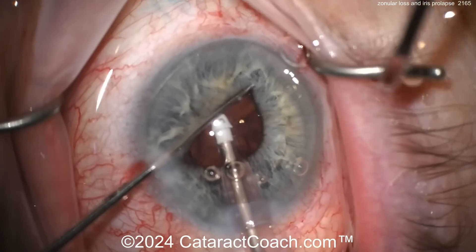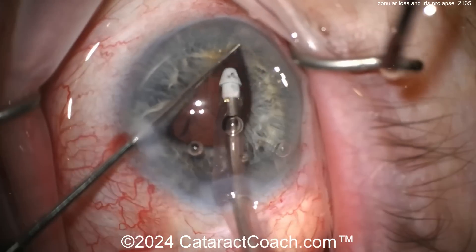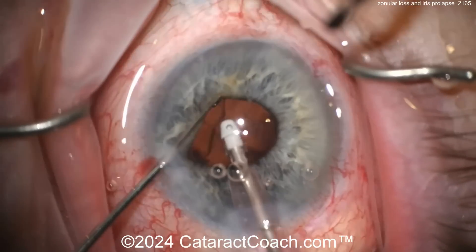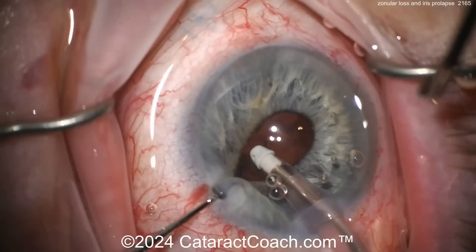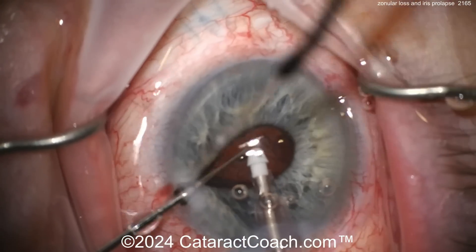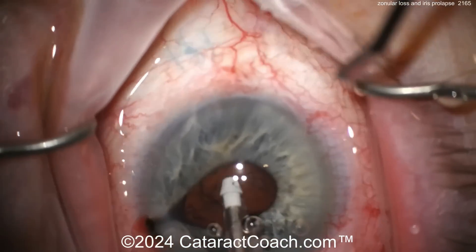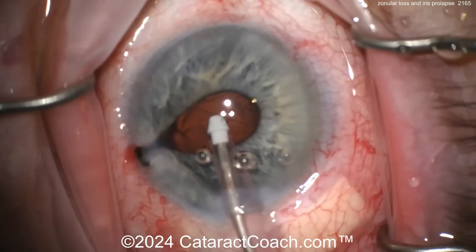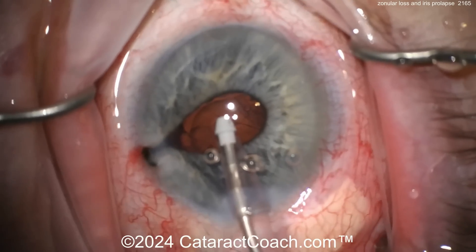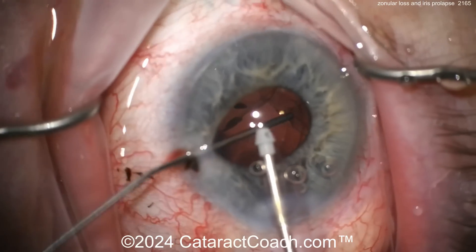You can see just how much extra cortex there really is — we're nowhere near being done. That second instrument — a chopper, a Kuglen hook, whatever else you want — just to get a good view. Be careful of not nailing the capsule or the capsule rhexis. That's a lot of iris prolapse. When the iris prolapses like that, the iris is mad at you. You may as well just want to put the hooks in and call it a day.